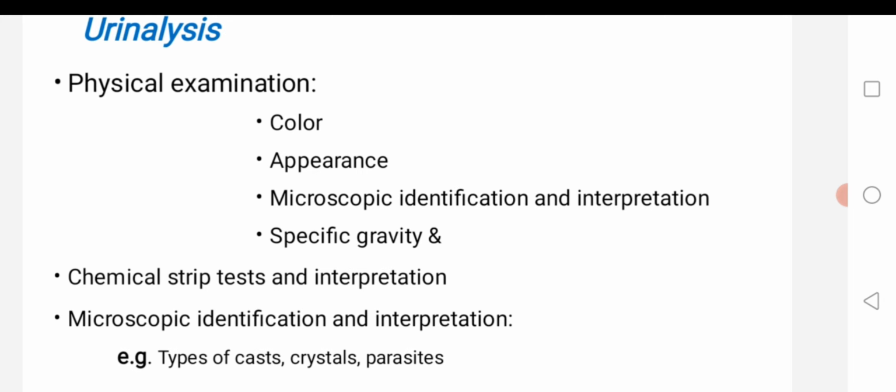We may be given a urinometer. One time I encountered this question: I was given only a urinometer, and I was asked to report the specific gravity. You may be given a refractometer or a urinometer, depending on what kind of lab you are in, and you may be asked to measure the specific gravity of your urine sample, and you will be evaluated.